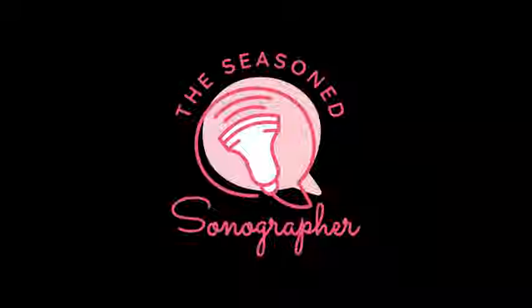In our practice, the experienced sonographers will assess the cervix transabdominally and measure it. And if they can't get a good image, or if the patient has a history of preterm labor and delivery, then they'll look transvaginally to be very accurate. Or if the patient is having symptoms of preterm labor or preterm delivery, then always look transvaginally.